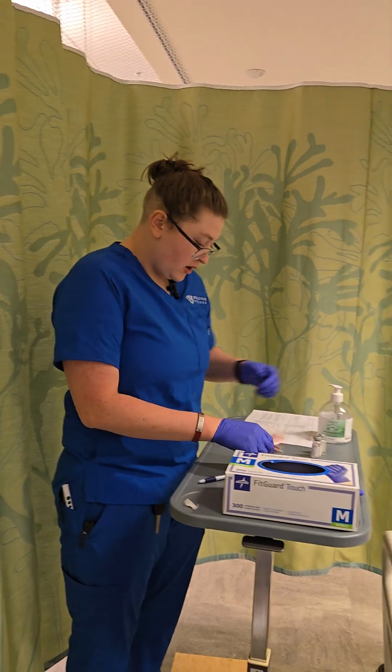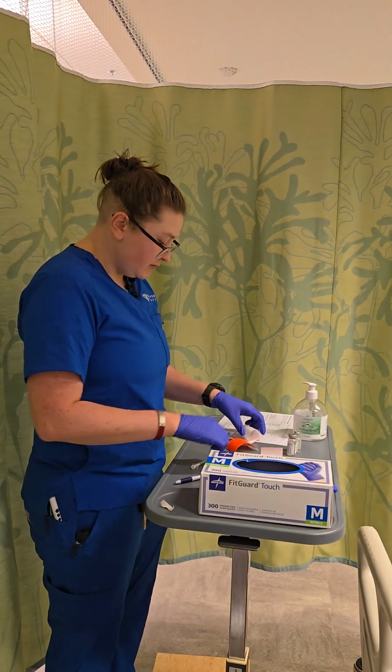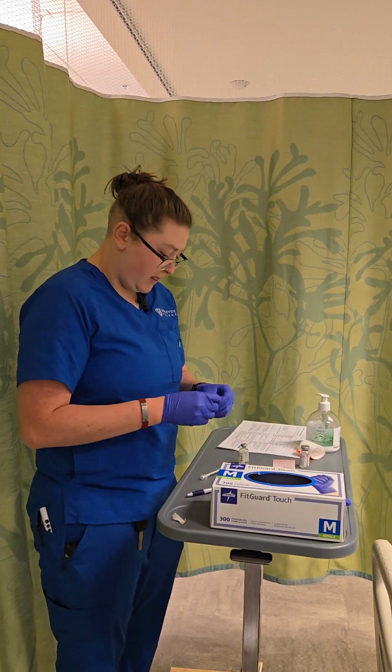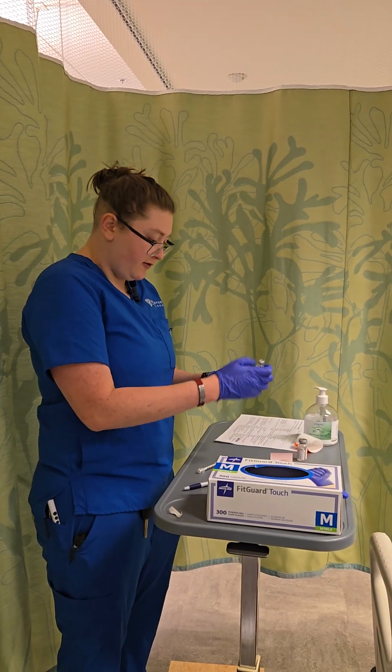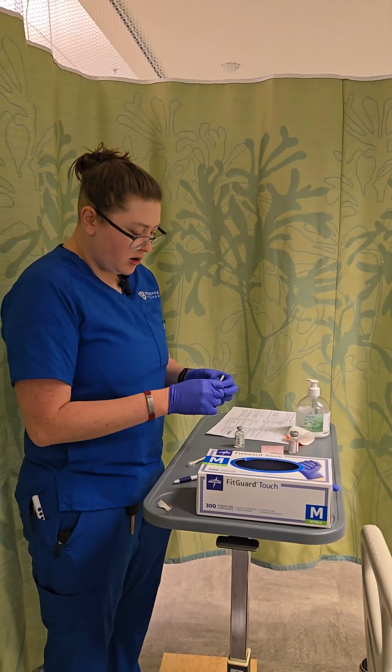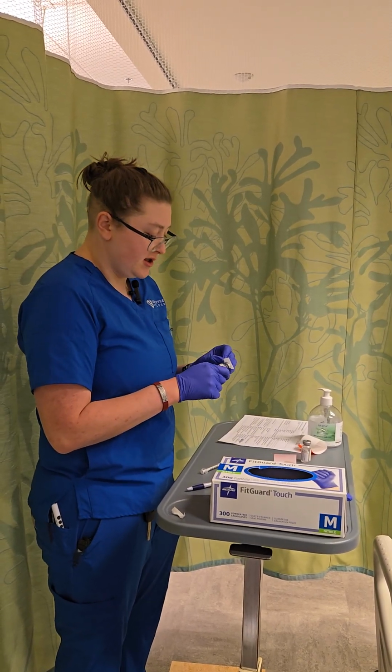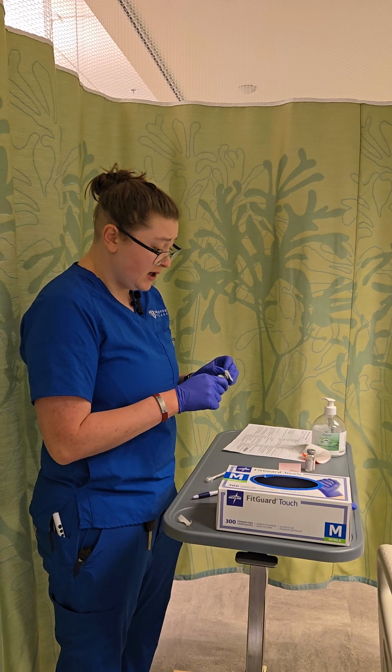Awesome. So next thing to draw up is insulin. The NPH insulin, I'm going to draw up. I'm going to pop the top off of the vial. I'm going to open the alcohol swab and rub. As I rub for 30 seconds, I'm going to think about the nursing considerations for both of these medications.